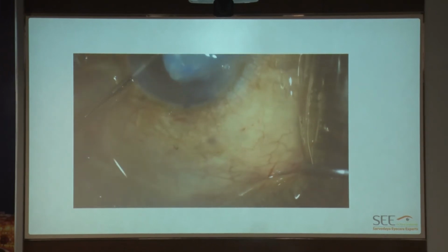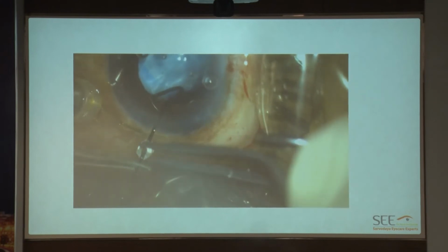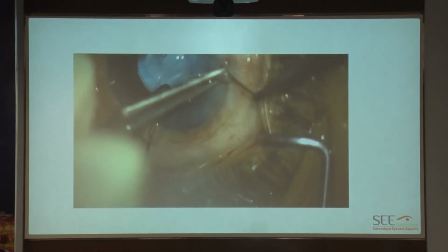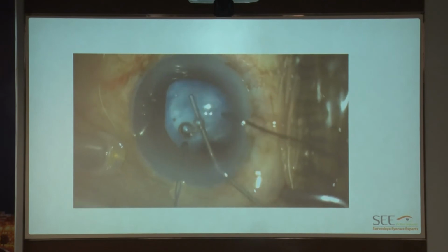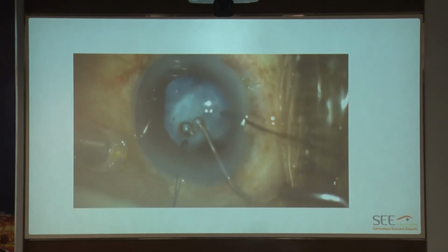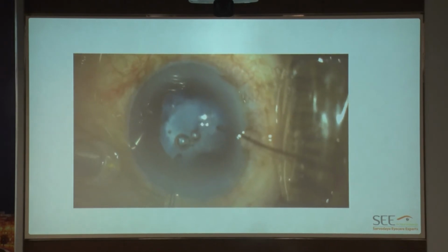And to our surprise, this patient did not have any nucleus. I didn't realize that because I had a standby retina surgeon. So we went ahead and I did the cortex wash manually. I did not go ahead with the IA. And we were able to do it. And once we did it, I saw that there was a large PC rent.